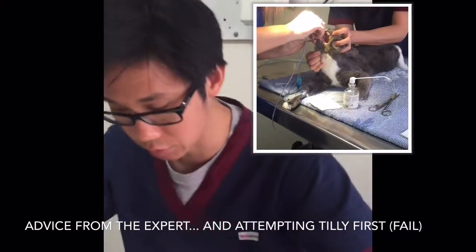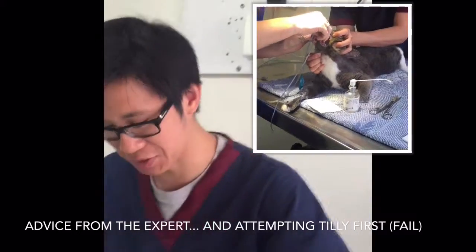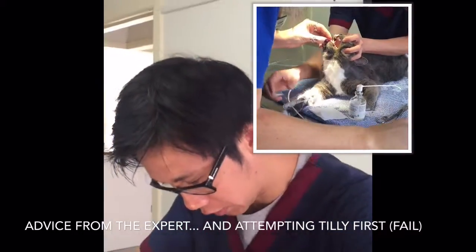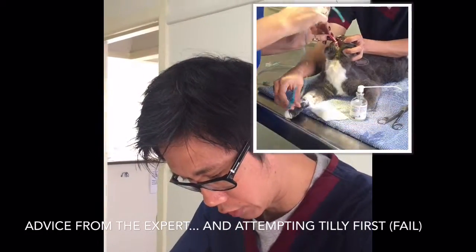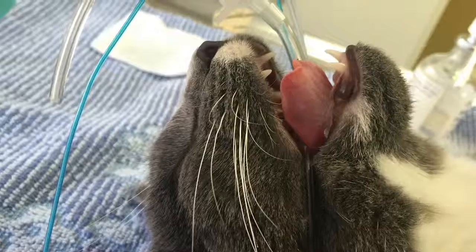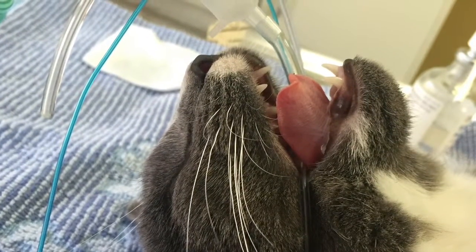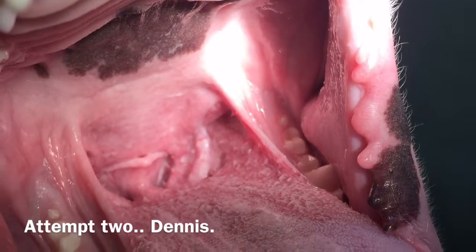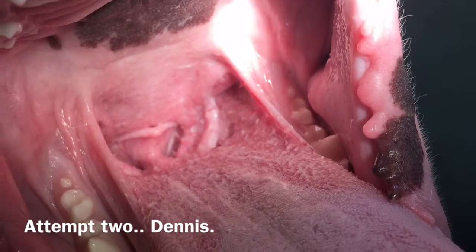I need the nurse to open up the animal's mouth as wide as she can while I pull the tongue out to be able to see the airway. I then spray a small amount of lignocaine into the area and wait for the airway to open. I'll lube up the endotracheal tube and introduce it into the larynx smoothly and straight down.